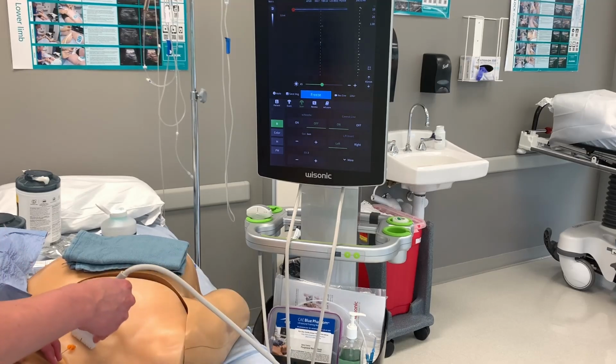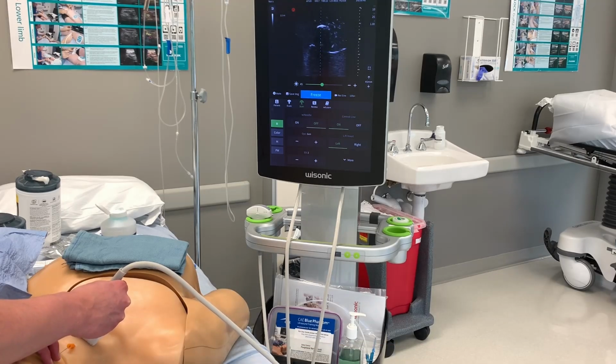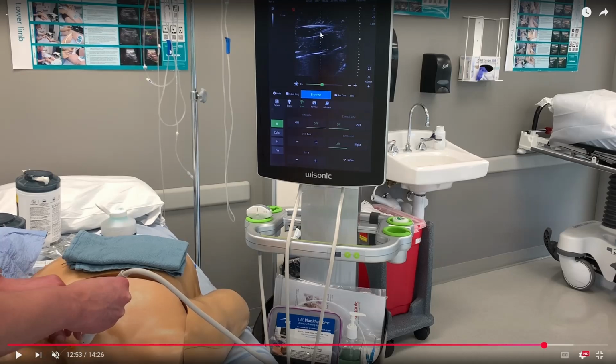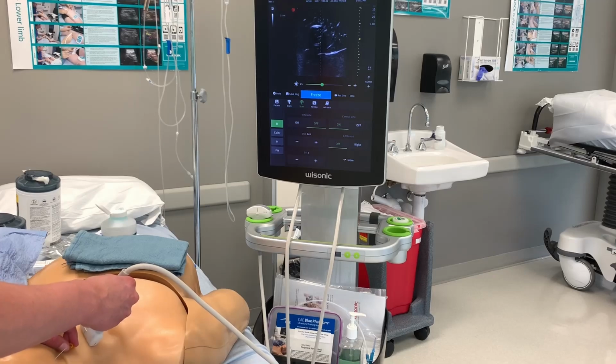And there we go. We now have the dilator over the guide wire, and we're going to take another look with the ultrasound. Another thing to note is there is no ultrasound jelly on this fake patient because I was lazy and did not want to have to clean it up. So again, we're checking for proper positioning, and you'll get a really good view right here. So if you can see this line right here, that's the catheter. I'm going to shake it with my hand, and you'll notice right up here it's going to jiggle within the vessel. And that, to me, confirms what I'm looking at is what I think I'm looking at.